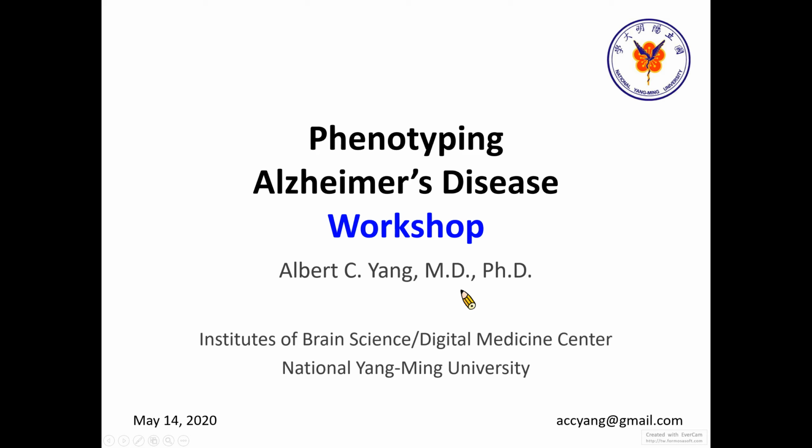All right. So after the lecture parts, I think that we can work on some real-world data about Alzheimer's disease. According to the agenda, we should have some dementia data, for example the questionnaire data and the EEG data, so we can phenotype Alzheimer's disease, or do a cluster analysis just based on this kind of data. That is the main topic we are going to explore today.